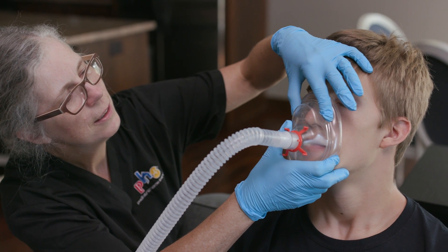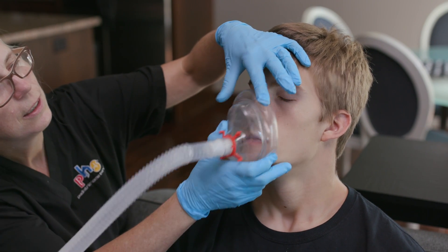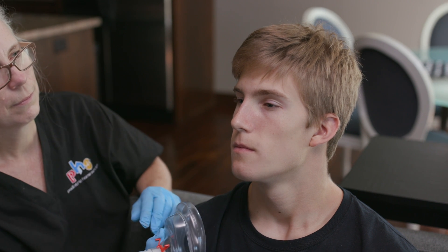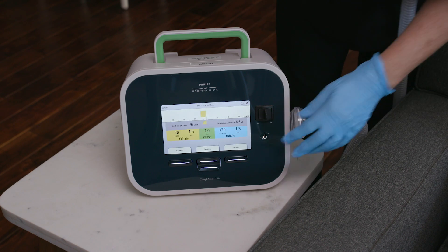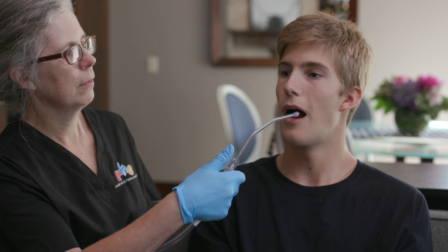After the prescribed number of cycles, allow the device to provide inhalation pressure one more time, then quickly remove the mouthpiece, mask, or adapter. Push the standby button on the device. Allow the patient to rest and breathe normally for 30 seconds to one minute. The patient may cough, huff-cough, or be suctioned during this time if needed.